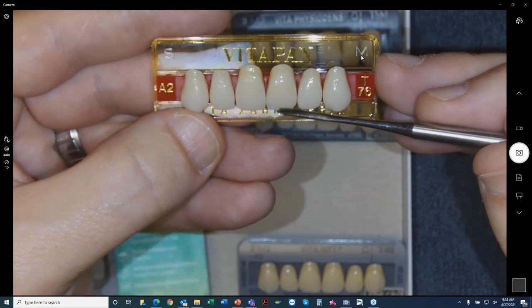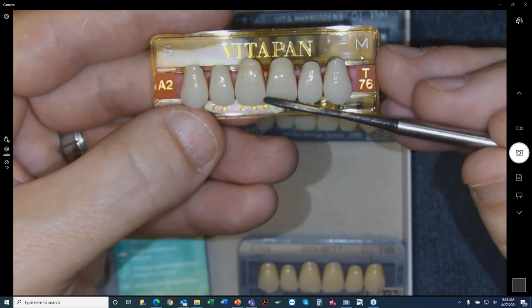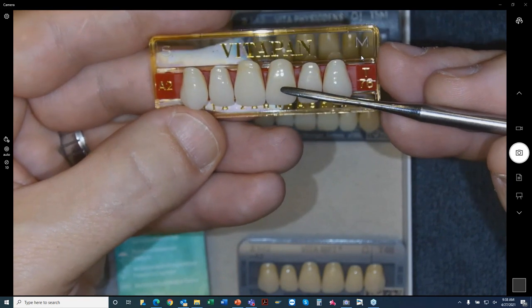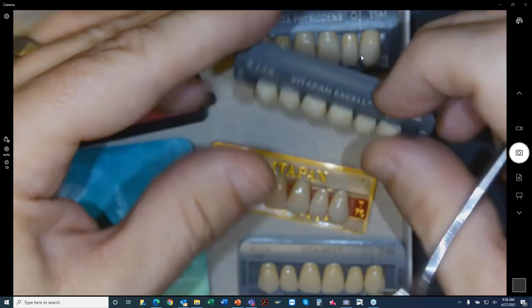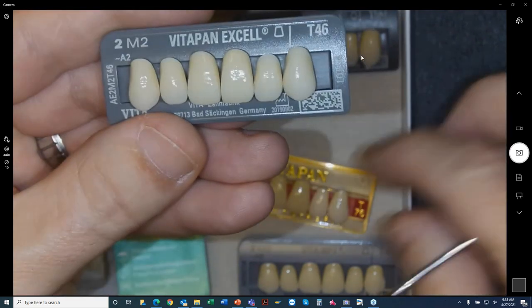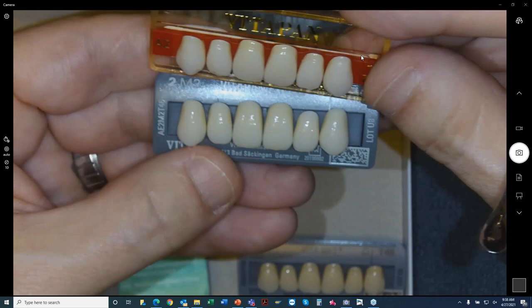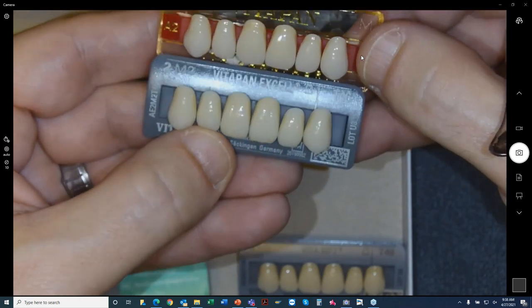But again, are we replacing the existing denture tooth, and does the patient really want that replacement? Or is it possible that we can move the patient to a little bit more of a youthful look that has a little bit more vitality, more translucency, more anatomy, and won't look as flat and polished?